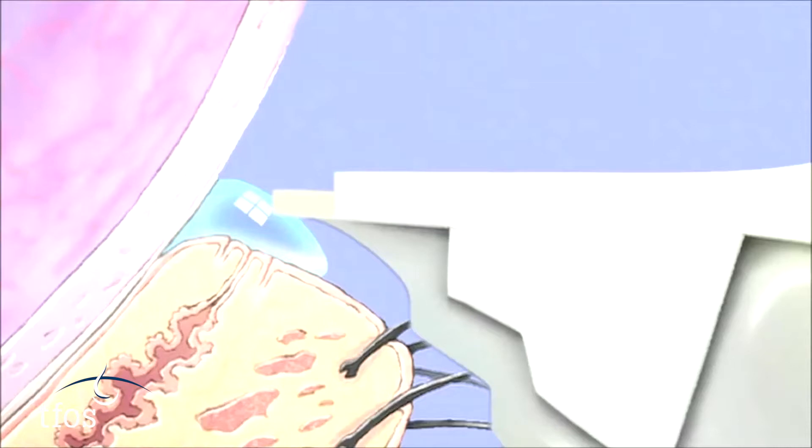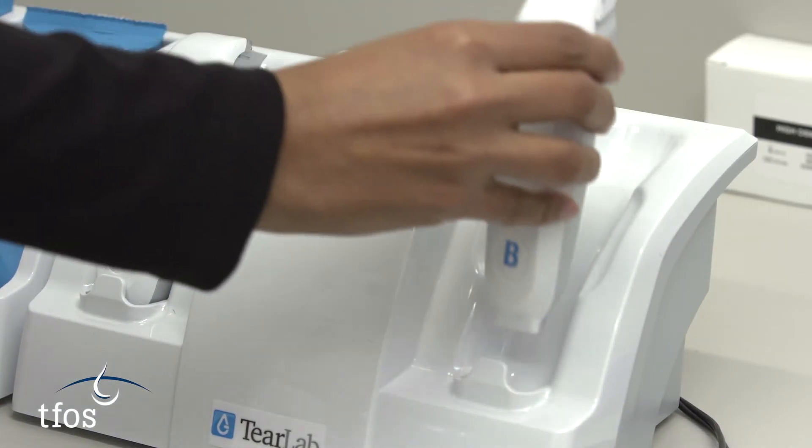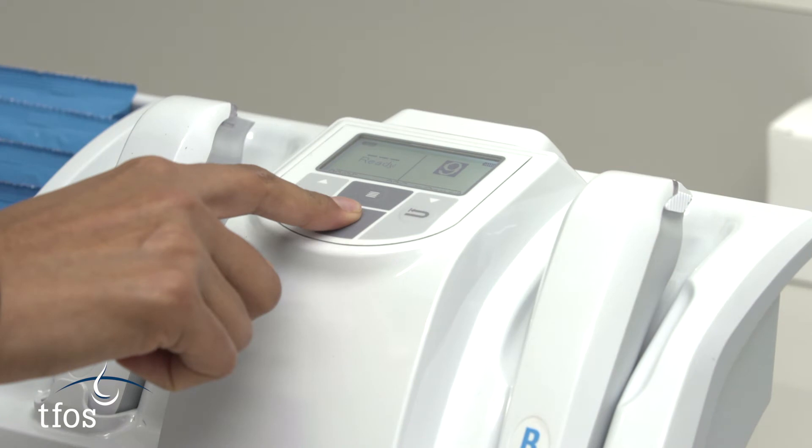When sufficient tear volume has been collected — around 50 nanolitres — a further beep will sound and the green light will go out. The pen is then withdrawn from the meniscus and transferred promptly within 40 seconds to the device cradle. Test cards are calibrated in batches during production; it is therefore important for calibration that the number shown on the device matches the number printed on the test card.